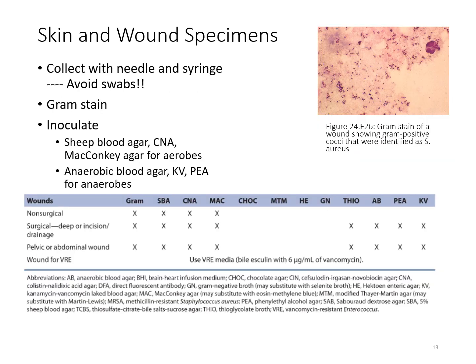Cultures for skin and wound specimens should include collections with needles, so just kind of aspirating out that infectious material. You want to avoid swabs with cultures. They're not really great for allowing your anaerobes to grow. And of course, when you're dealing with anything that's deep within the tissue in the body, you do kind of have to suspect the potential for an anaerobe.